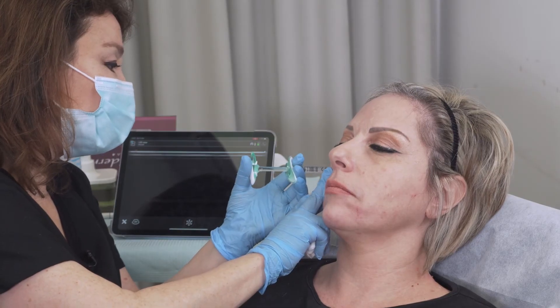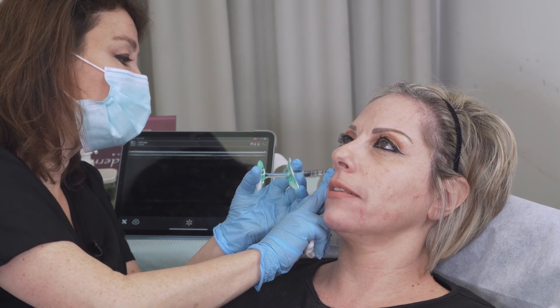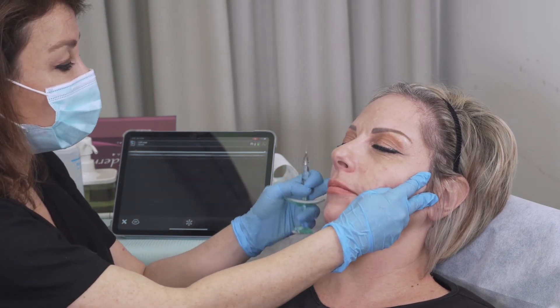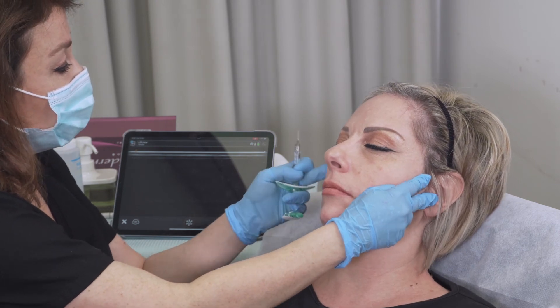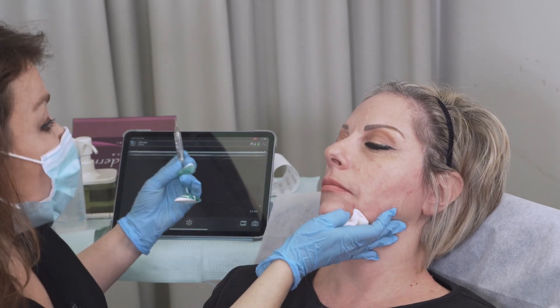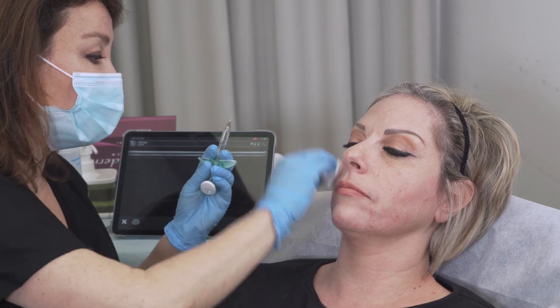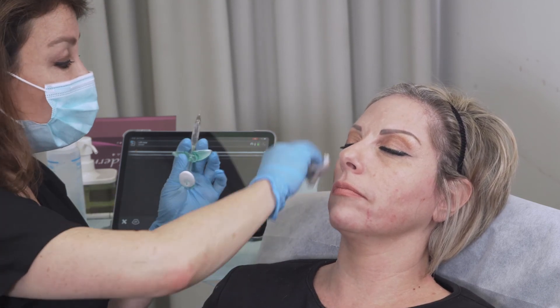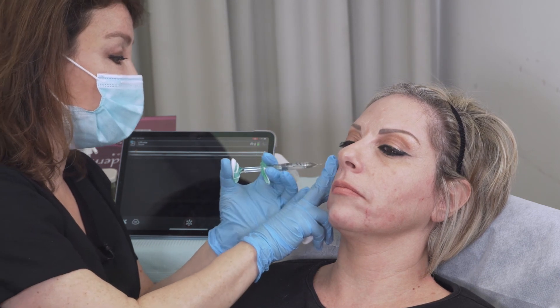I can easily inject the lateral sides. Here, I'm injecting on the bone — I'm actually going deep, on the zygomatic bone — and that will give us a very nice result. I'm far from the vessels in this area, because the vessels are more medial.